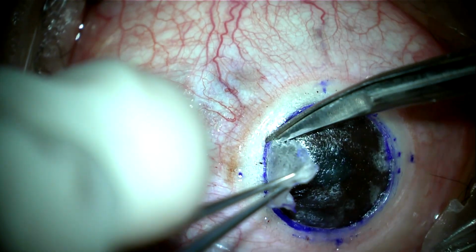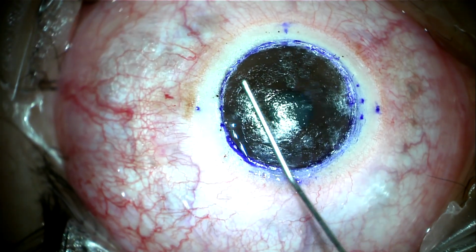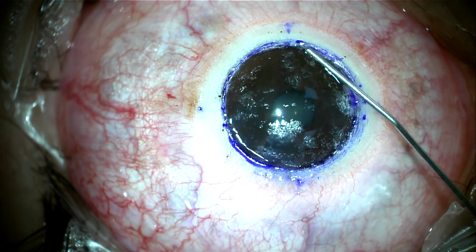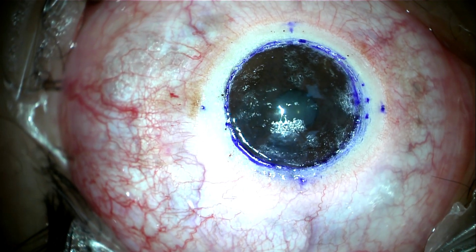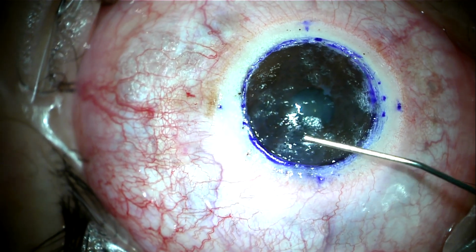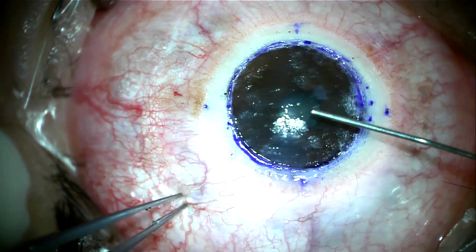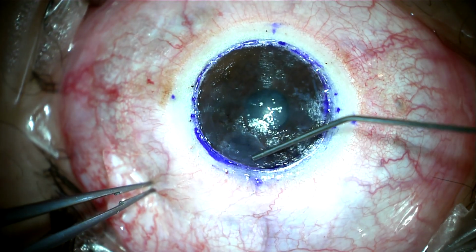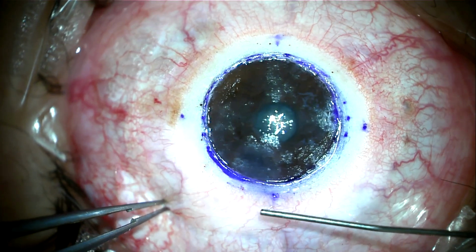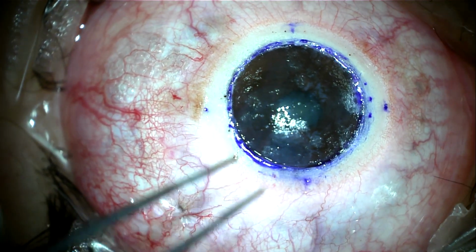After finishing dissection of this layer, wetting of the stroma is done to inspect the bed. Inspection of the bed revealed the presence of a small peripheral type 2 bubble. Opening of the roof of this bubble will lead to bare Descemet membrane, which is fragile and can burst easily. It is desirable in eyes with type 2 bubble to continue layer by layer dissection and bare Descemet membrane in the central area only if needed.